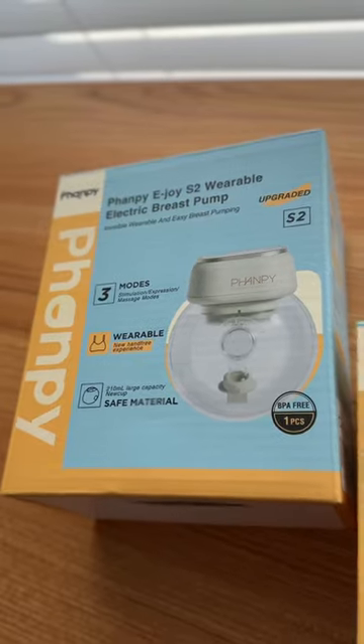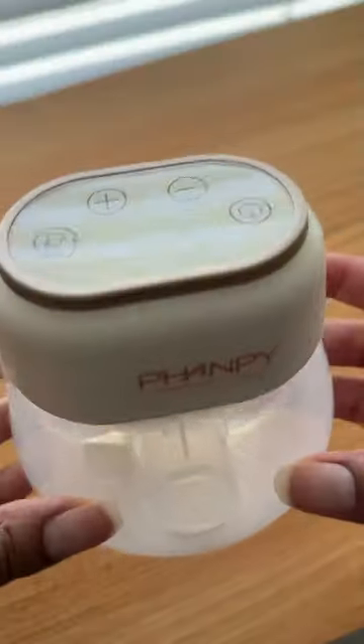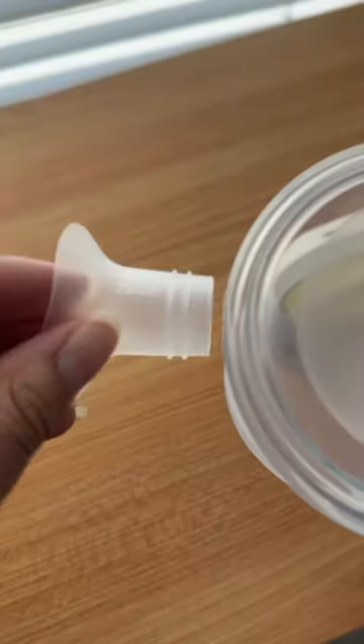Let me tell you about the FAMPY EJOY S2 Wearable Breast Pump. This pump includes everything you need for quick and easy pump sessions wherever you are. It includes an extra replacement duct bill and a 20mm flange insert, which is an added plus.